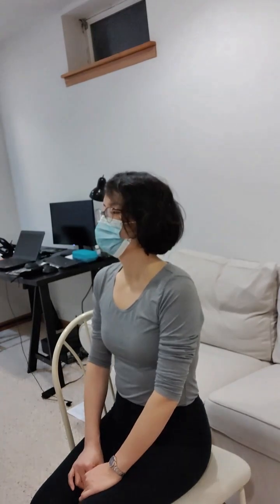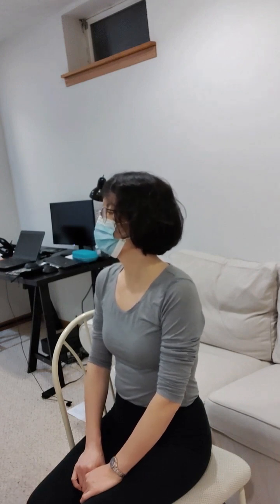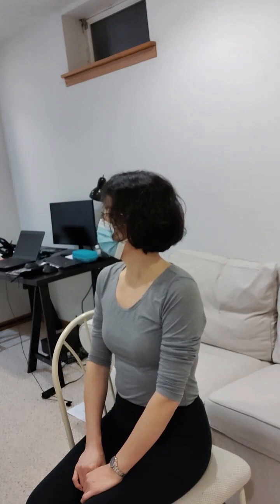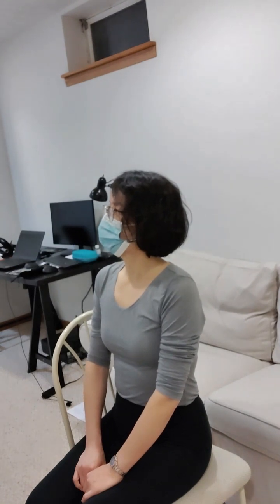Okay. Now the next one, I'm going to measure your diaphragmatic excursion. So what I want you to do, firstly, take a deep breath, then exhale all the air and hold your breath. Is that okay? Yeah.